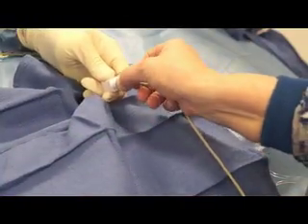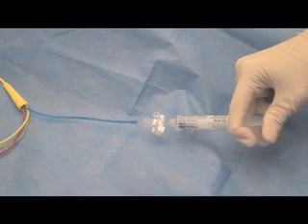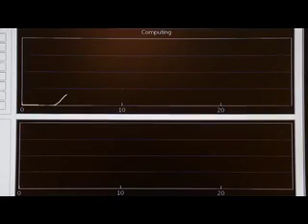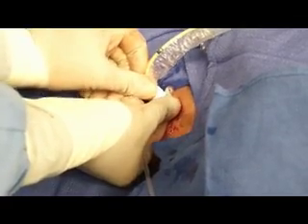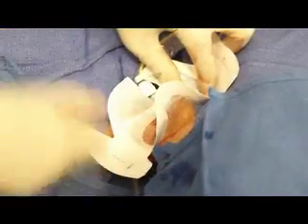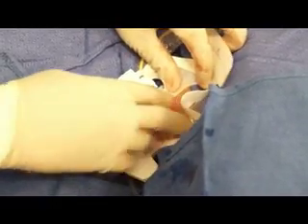Measure cardiac output by connecting the thermistor to a computer and injecting a saline bolus into the right atrium. On a plot of temperature against time, the area under the curve is inversely proportional to the cardiac output. Fasten the plastic sleeve to the sheath and secure the catheter. Suture the sheath to the skin and apply an antibiotic-impregnated adhesive dressing over the wound.